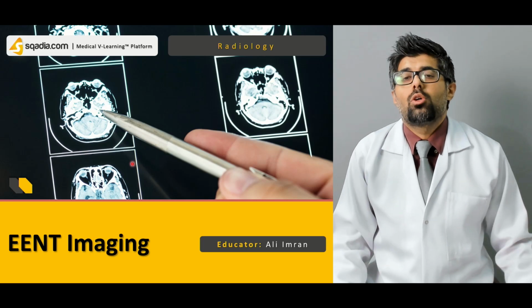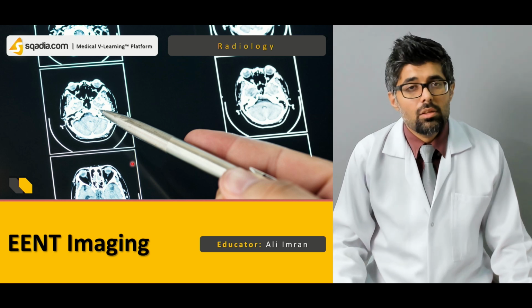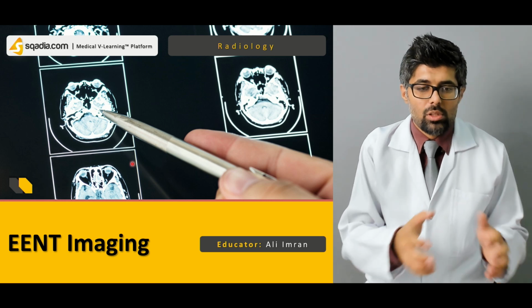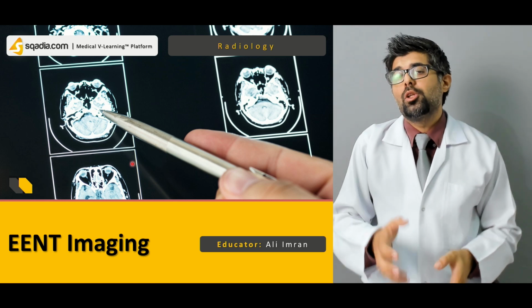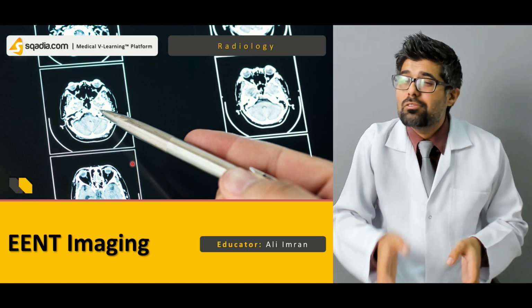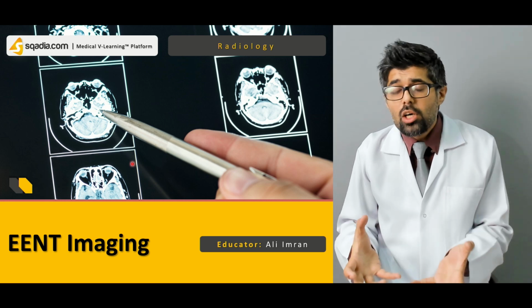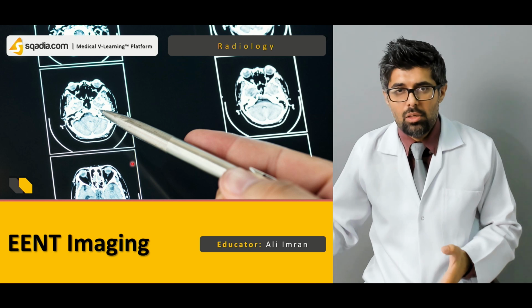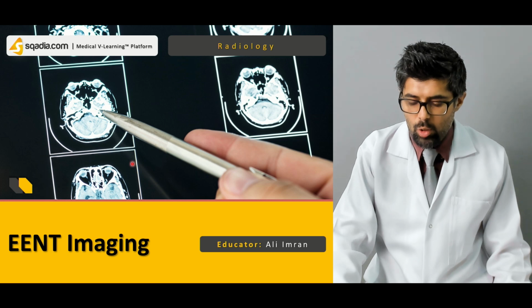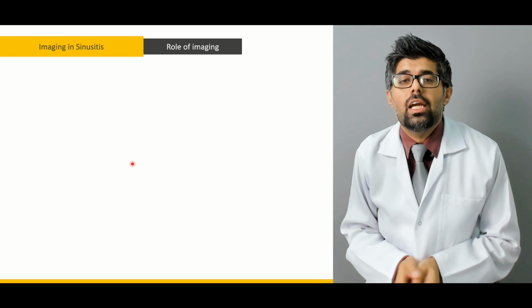Today, our lecture is on EENT imaging. EENT stands for ear, eye, nose, and throat imaging. Now, EENT imaging overlaps with neuroradiology, but it is its own entity and it is very different from neuroradiology. How come? We'll study that in our lecture. So, without further ado, our first topic is sinusitis and the role of imaging in it.